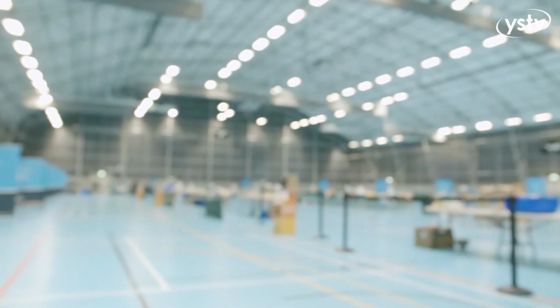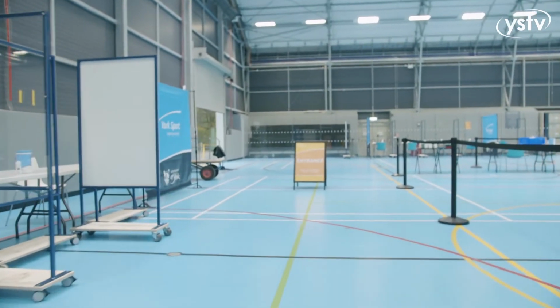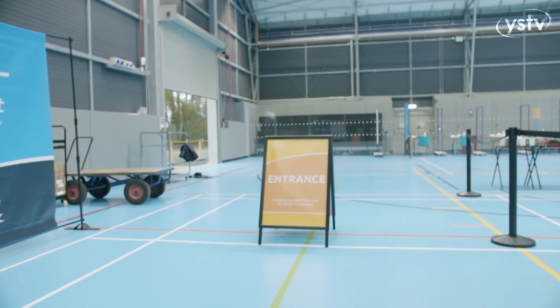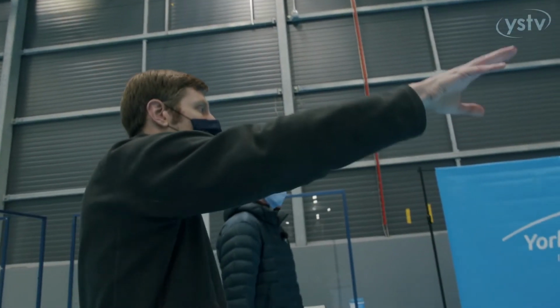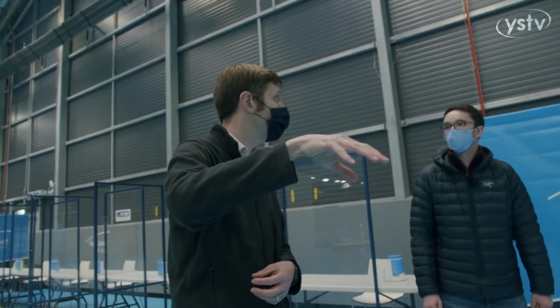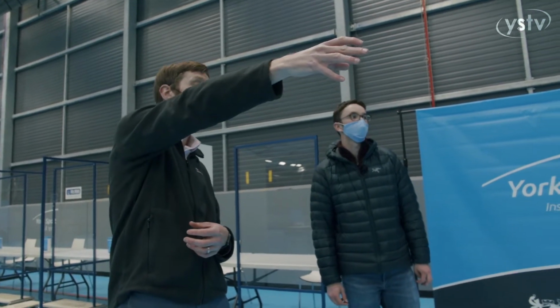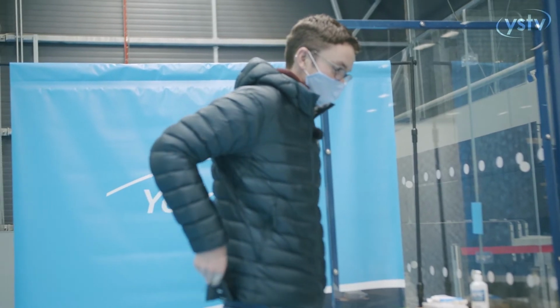So once we've registered, we're moving down this way. So you'll then move down this way, and you've got yourself registered, you've got your barcode, and you'll then have to wait here just for a few seconds while we work out which of our bays is free. So we've got 48 swabbing stations around the hall, and we'll be sending people around in batches of 4 to these locations. So we'll assume that the first bay here is free, and you'll get signalled there by the test supervisor, and we'll wander over to this bay.